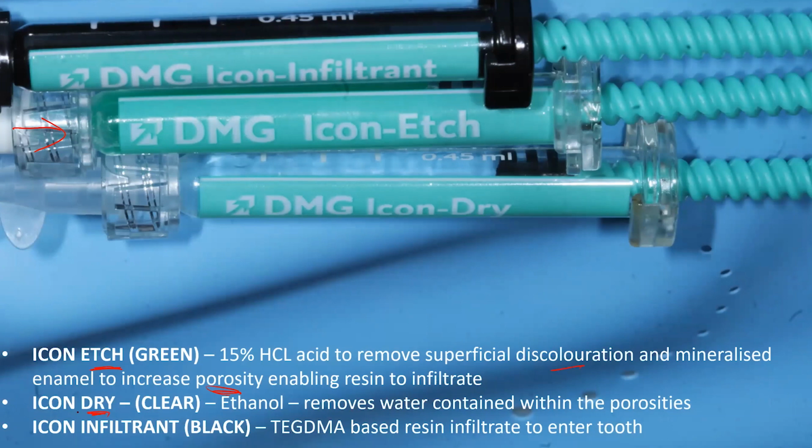Then we have the Icon Dry, which is this clear substance here, and that is the ethanol, 99% ethanol, I think it was, and it removes the water contained within the porosities. And this sort of starts to give you a kind of a preview of what the tooth will look like once you infiltrate it. But I'll come on to that later on.